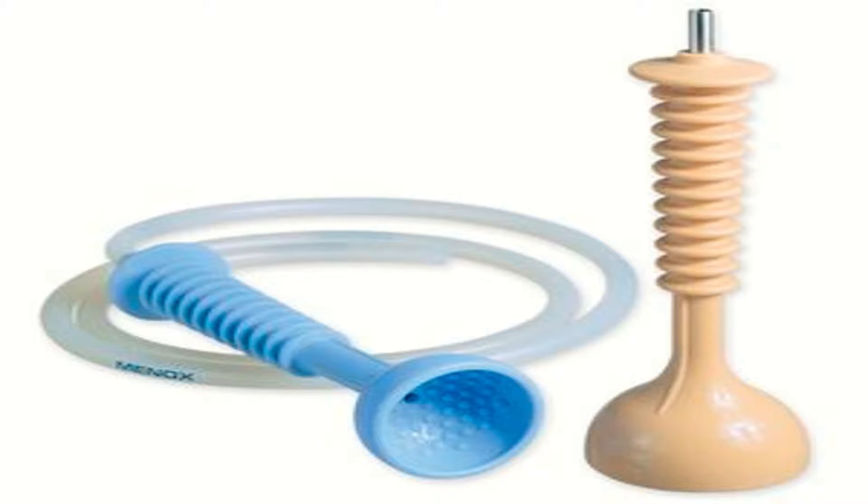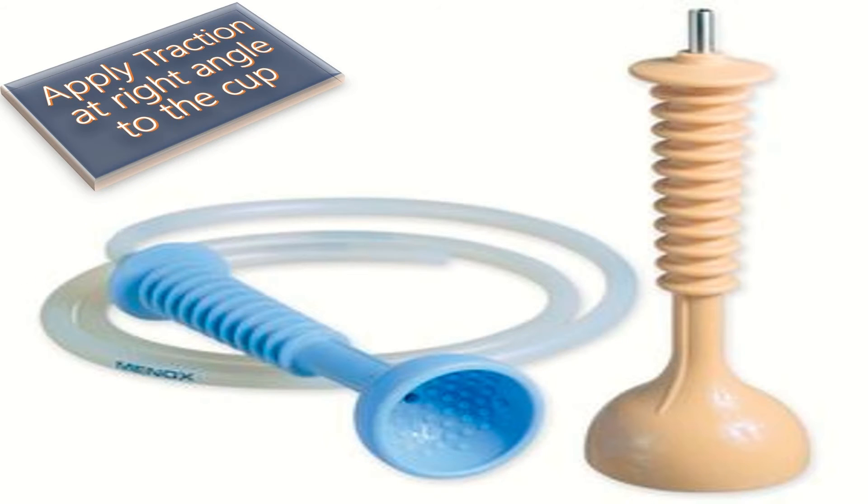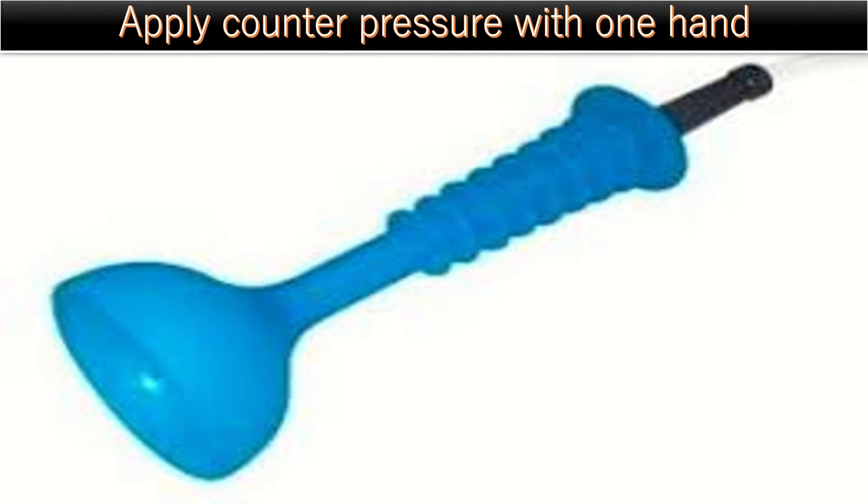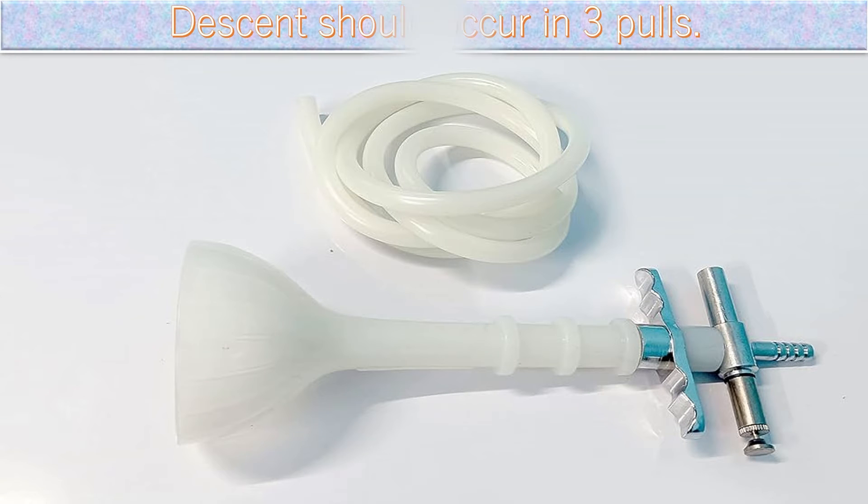I will apply traction at the right angle to the cup, synchronous with the uterine contractions and maternal bearing-down efforts, in the direction of the birth canal. During traction, I will apply counter-pressure with my left hand by keeping the thumb on the anterior part of the cup and fingers on the scalp to prevent slipping.